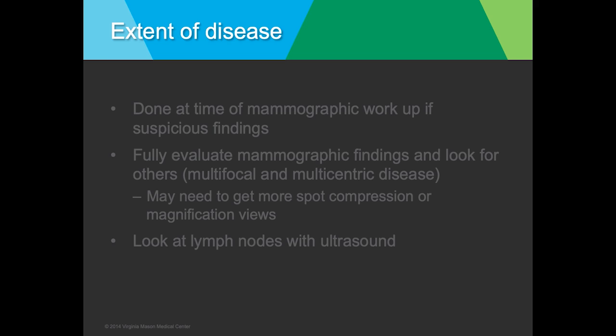It's also important to look at the axillary lymph nodes with ultrasound to make sure there are no findings to suggest lymph node metastases. And if there are, to go ahead and biopsy those at the same time as biopsying the other findings in the breast.